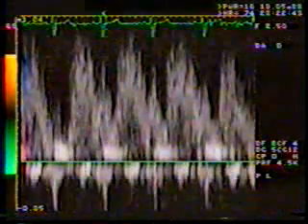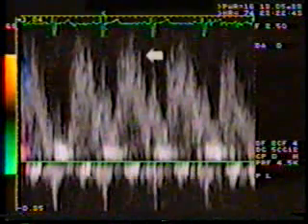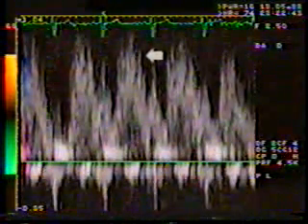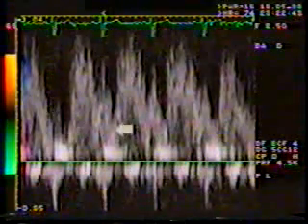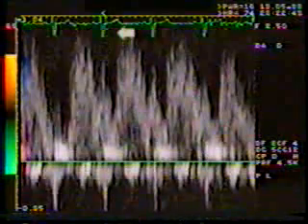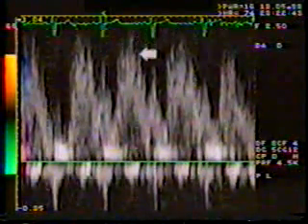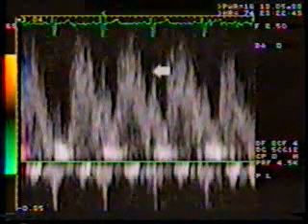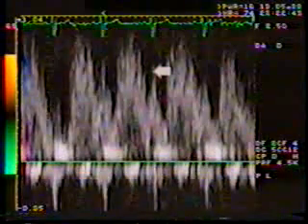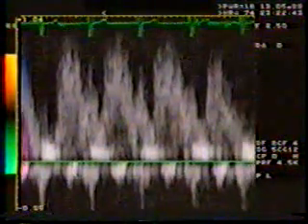This freeze frame demonstrates the characteristic spectral profile of the shunted flow. Note that the left to right shunt commences during end systole, is holodiastolic, and there is further accentuation after atrial systole. Note also that this is a turbulent flow pattern.